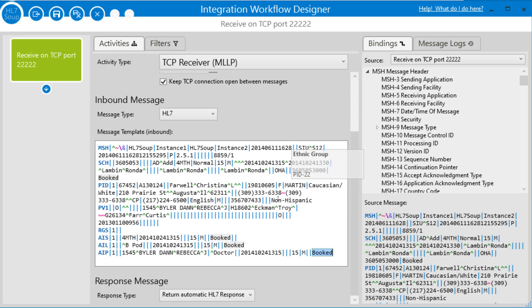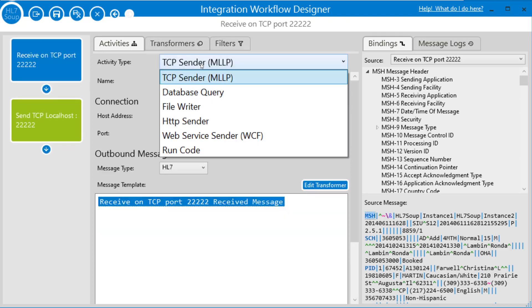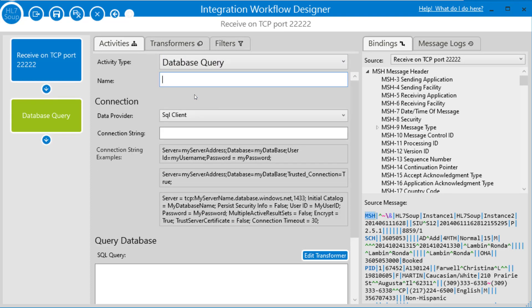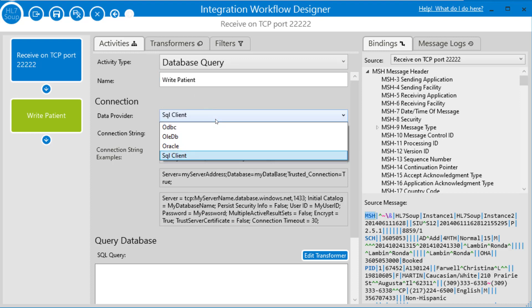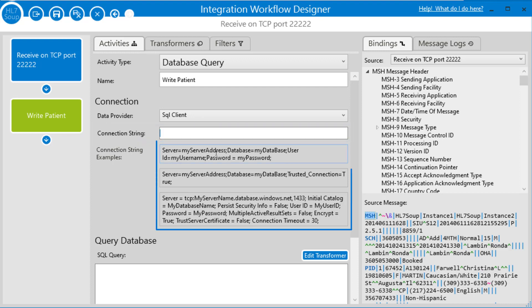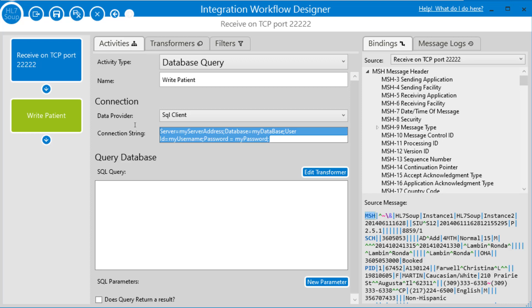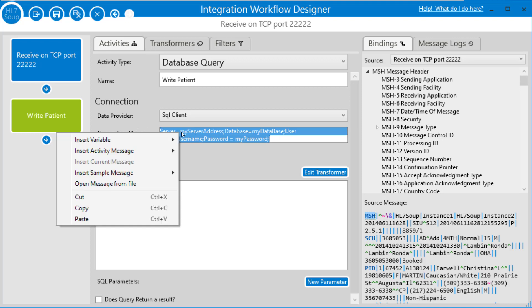And so now let's create an activity to write this data into a database. I'm going to click here, add a new activity, and we can change that across to a database query. We'll give it a name, write patient, and then I choose which data provider we're using. We are going to be using SQL server, so SQL client, and then I just need to add in the connection string. There are some example connection strings available for you if you need some help creating your connection string, and you can just double click on them to use them, and you just need to change the password and the user ID. I happen to have mine on the clipboard, so I'm just going to paste it into the message.